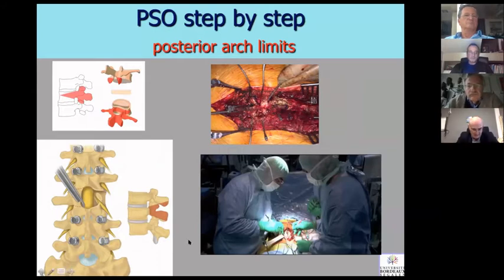And as you can see here, I keep this inferior part of the lamina of the vertebral body, at the level I want to do the osteotomy. I keep this piece of bone because when we will close the osteotomy, this piece of bone will come in contact with the other one here. So you remove the posterior arch. You can do it using the Kerrison Rongeur.